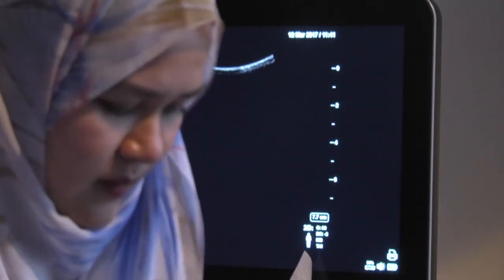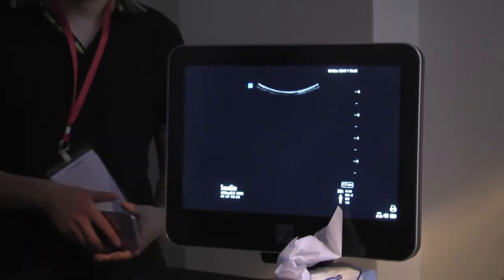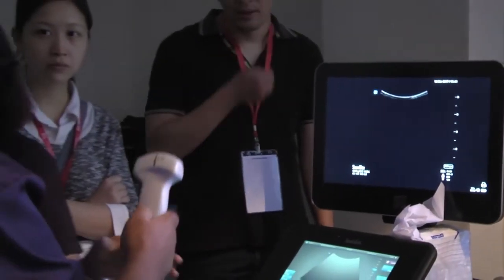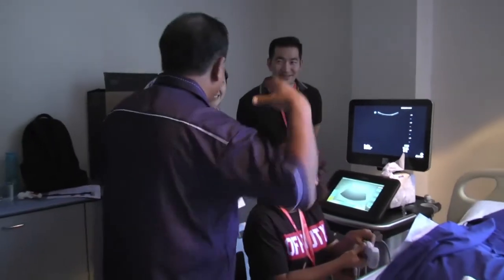So you still need to do the loss of resistance, is it? Yeah, of course. We don't have 3 hands, so we're not like Shiva. We have Indian gods who have many hands, you know.